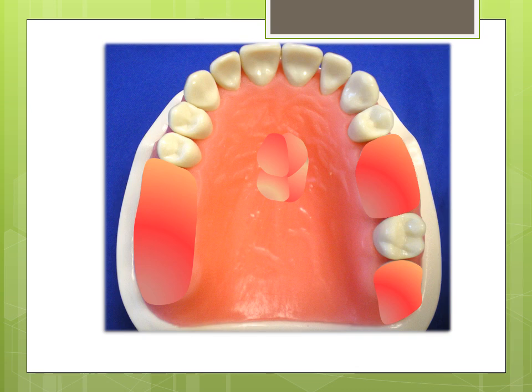The patient is happy with her appearance, but has had endodontic treatment on the maxillary incisors and the condition of these teeth is stable but questionable.